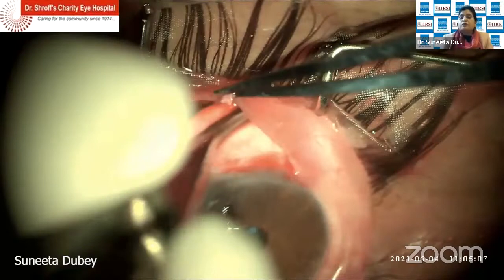Yes, so Dr. Murli or Dr. Gadi. Also, releasable sutures. Reena, you put releasables every time, because you can't do suturolysis. Yes. So, do you use Ologen or even Avastin? Yes, madam. I don't use Avastin with Ologen. My three indications for Ologen: number one is when I'm operating on a young patient with traumatic cataract, as Dr. Reena mentioned, traumatic glaucoma. You don't want hypotony.